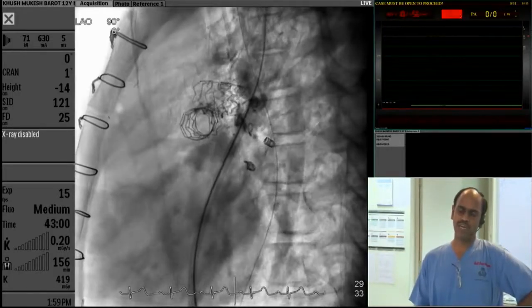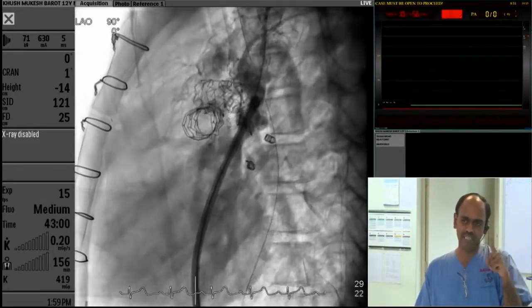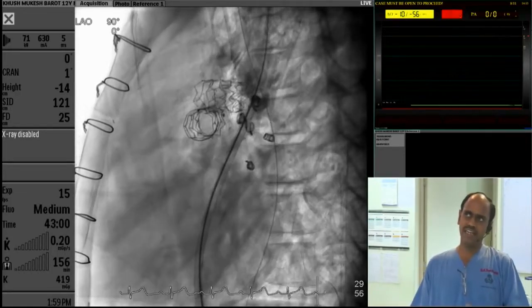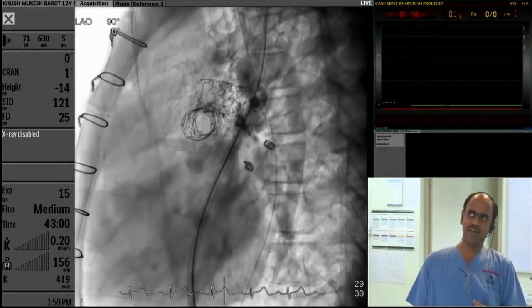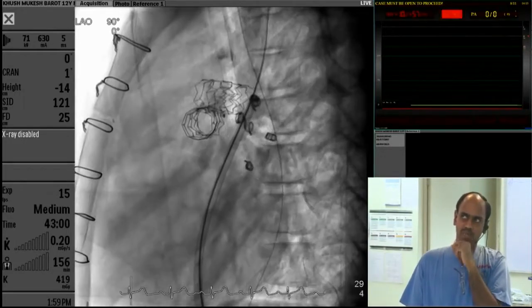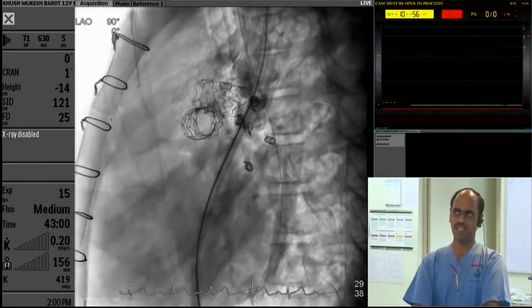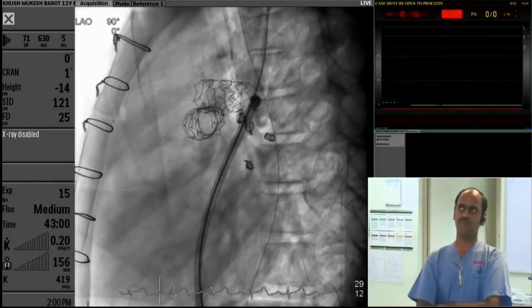The catheter was showing a pressure of 20 to 22 mmHg, which was similar to my previously recorded superior vena caval pressures. The RA pressure was around 10, giving a gradient of around 10 to 11. I did just a flush injection. I advanced the sheath over the guide wire into the superior part on the anteroposterior projection, then turned to the lateral projection and injected. I was able to see the azygous filling down. The superior vena cava was filling the azygous nicely, but the azygous was not good enough to fully decompress the superior vena caval pressure.